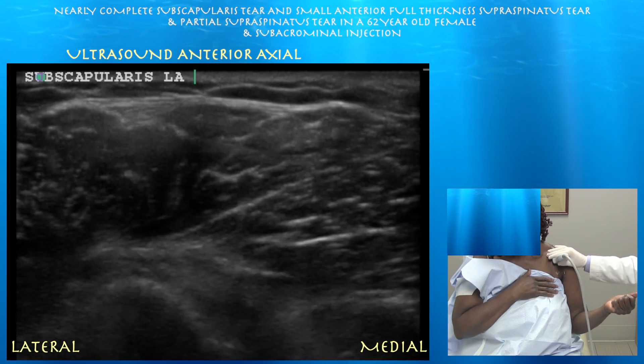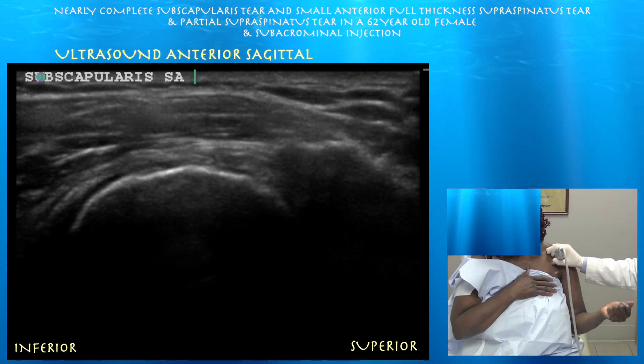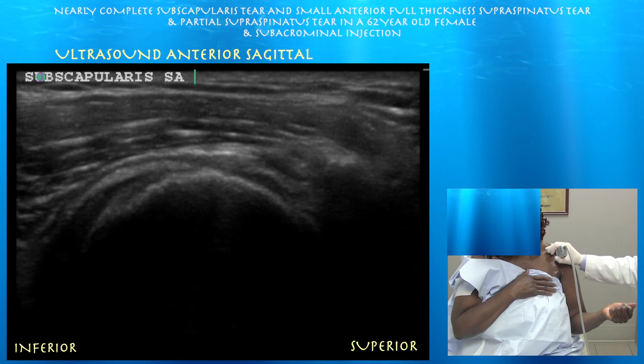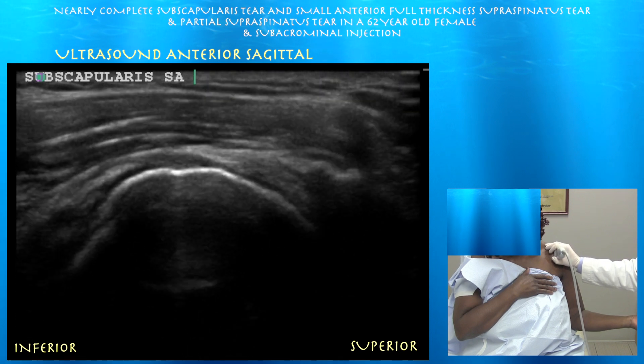She did have a negative liftoff and a negative liftoff lag sign, which is not consistent with her ultrasound findings. Now in short axis, left side of the screen is inferior. Again, we're just not seeing much of a tendon. You can see the subscapularis void — essentially just like any complete rotator cuff tear, where you just don't see a tendon and you see the overlying muscle dropping down to the bone.